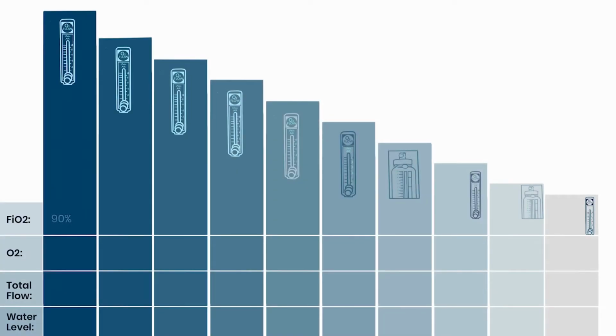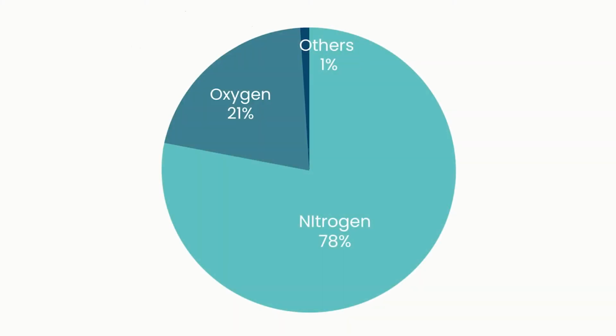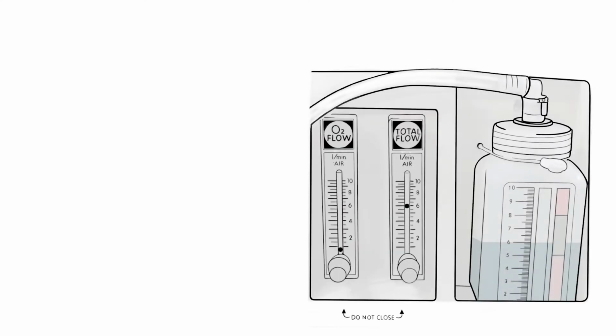As we increase or decrease CPAP treatment, we will need to do this in even steps, usually by changing the FiO2 by 10% at a time. This is not a simple calculation. Remember, the air already contains 21% oxygen. In other words, atmospheric air has an FiO2 of just over 20%. So on the CPAP, to produce this, the oxygen flow meter will be showing 0.